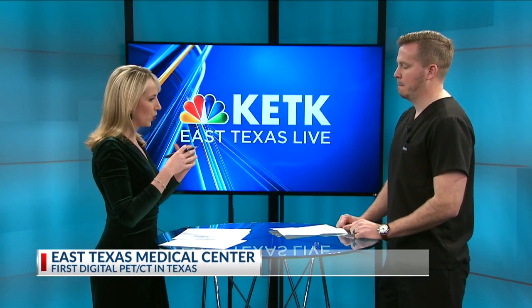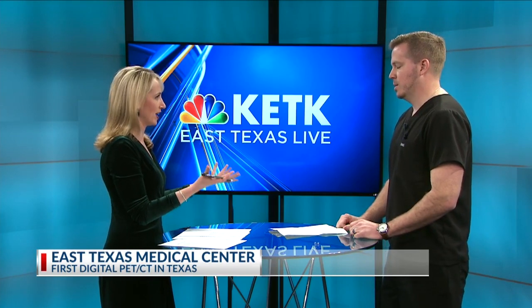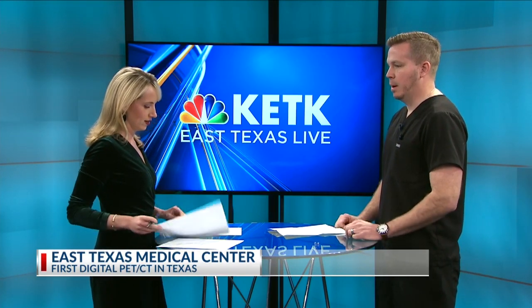Okay, so tell us, what is the PET CT for those who don't know what this piece of equipment or technology is? So basically, anyone that's had a family member that's had cancer has probably dealt with a PET scan before. Doctors are typically going to order a PET scan on someone that already knows they have cancer, but they send them to us to further diagnose where in the body that cancer's at. That way they can use that information to stage the disease and evaluate if they need any kind of surgery, what kind of treatment they want to do.